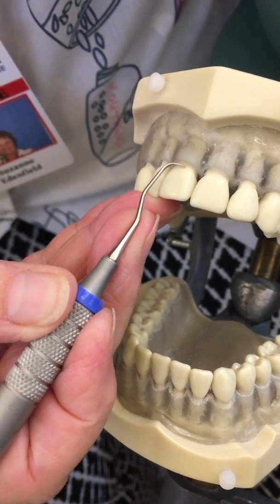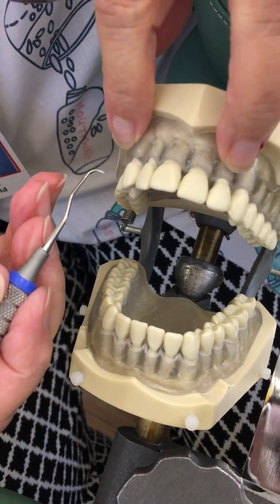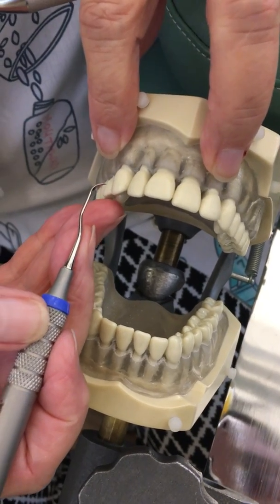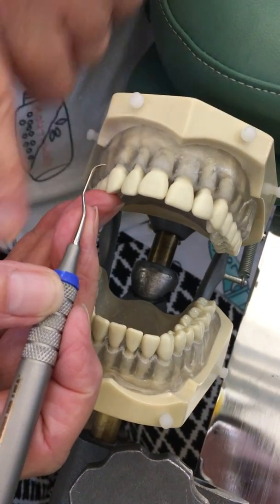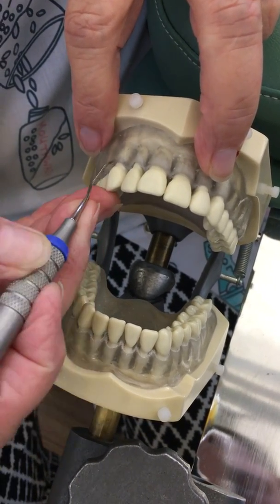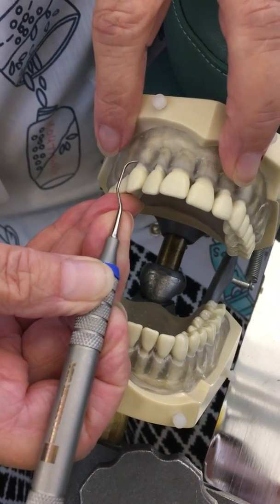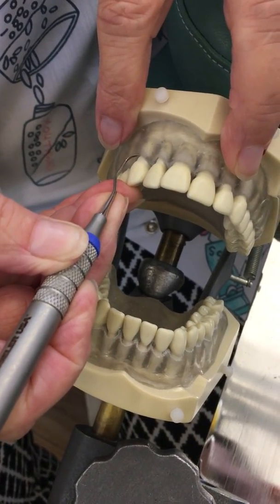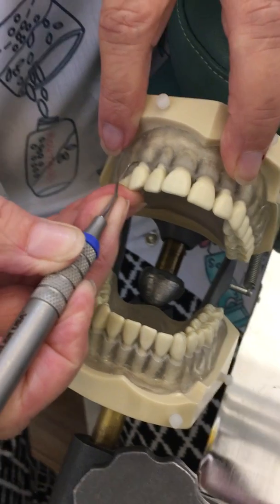Now I see the back. I'm going to retract the lip with my index finger and second finger, non-dominant hand, with my mirror palmed in case I need it. I'll place my fulcrum on the occlusal or incisal edges with my palm parallel to the maxillary arch, go in closed to a zero-degree angulation, insert my toe apically, then pull my shank slightly away from the tooth to open up my blade — somewhere between 60 and 90 degrees.